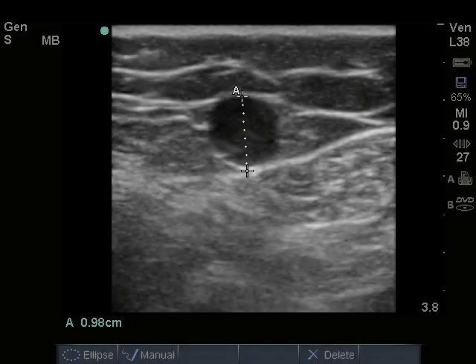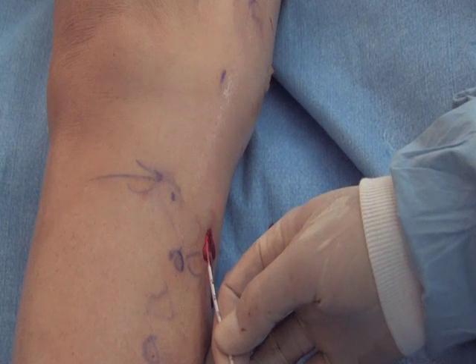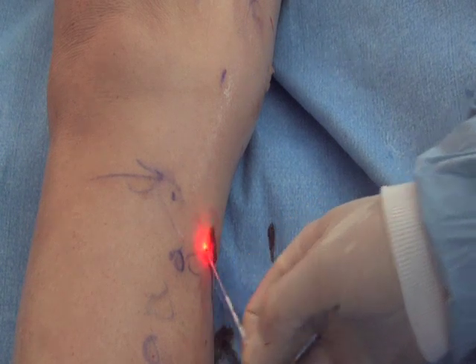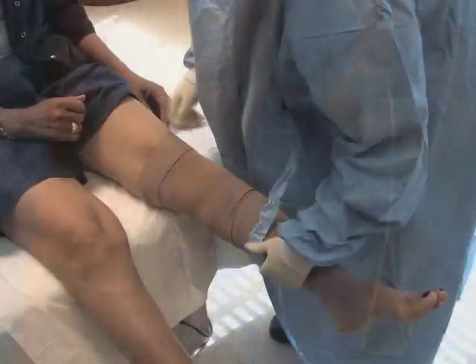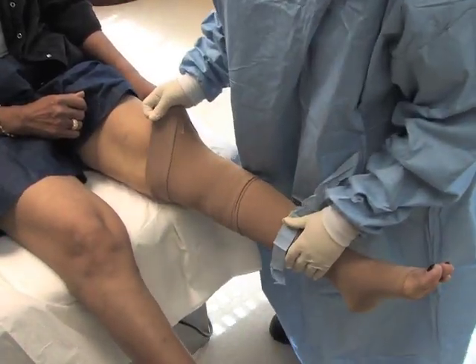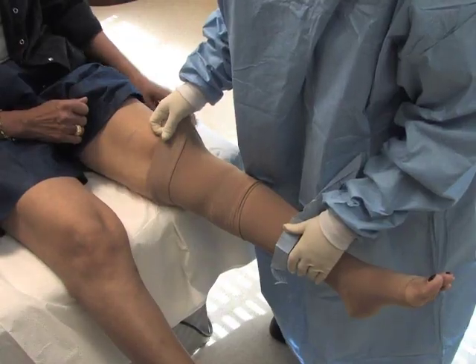Ultrasound is used to identify incompetence of the greater saphenous vein in the 51-year-old patient with varicose veins. She elects to undergo EVLT and the ultrasound-guided procedure is completed with ease. She is discharged from her clinic visit with compression hose and no limits on her activity.